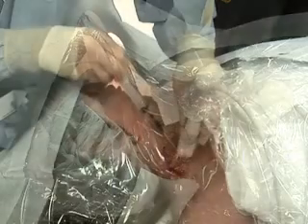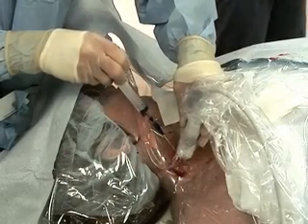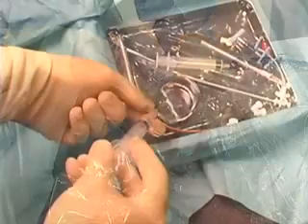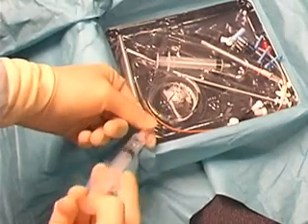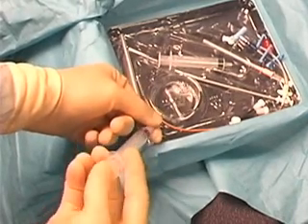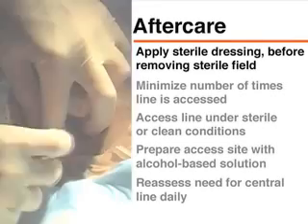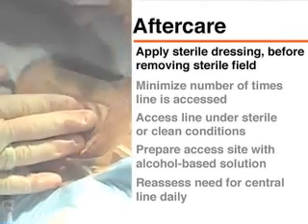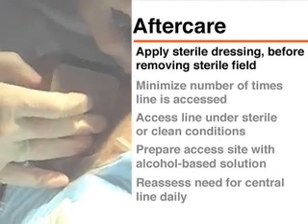If the vein has been difficult to cannulate, the presence of a clot in the needle will further complicate assessment of whether the vein has been successfully entered. In this circumstance, remove the needle and flush it thoroughly with saline to clear it before re-attempting placement of the line. A sterile dressing should be placed on the insertion site. The dressing should be changed daily, and whenever blood or liquid accumulates or it loses its seal.